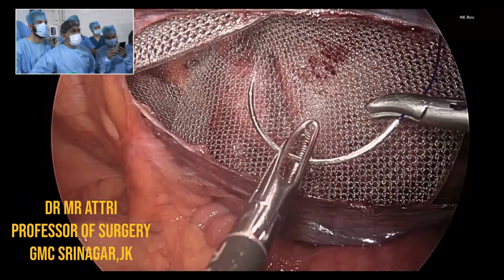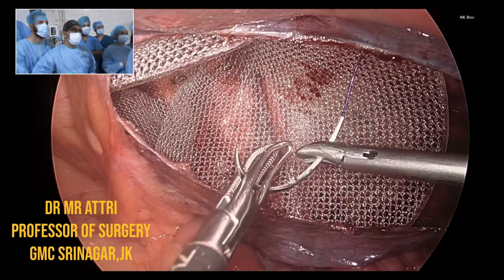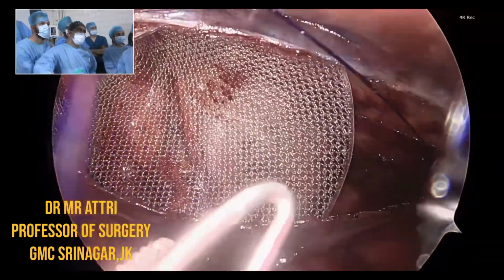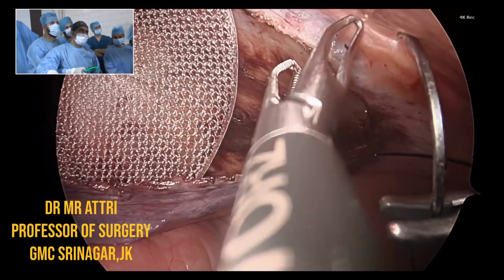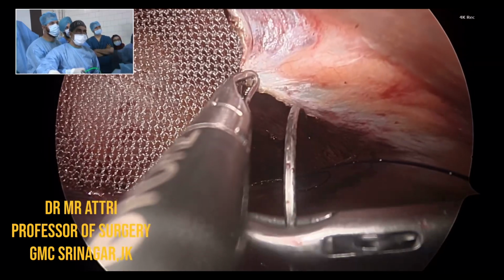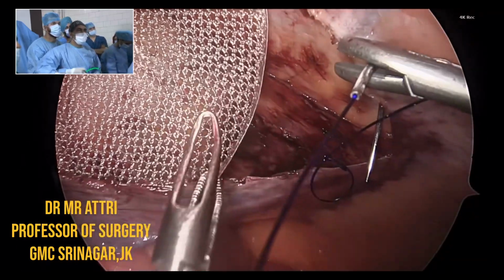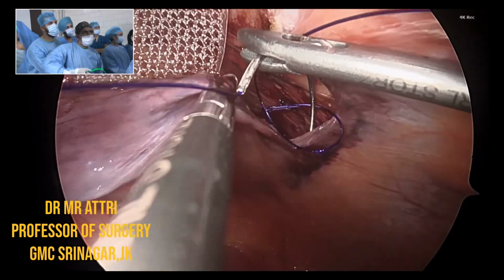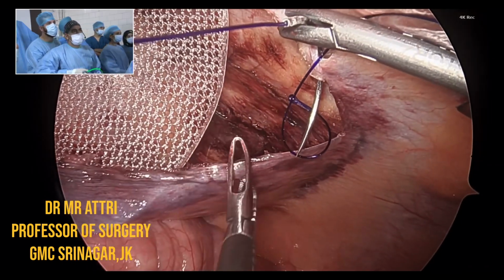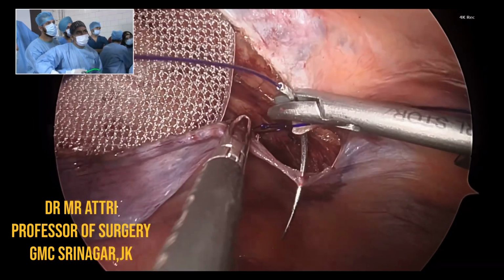Yes, we can. There is no need to dissect the sac up to the fundus in the scrotum. We can transect the sac, and that's what we call a herniotomy or circumcision of the sac. We can keep the distal sac as such, or we can fix it. It's not that fixation; we are just discussing a large direct hernia. There is a big pseudo sac, not a sac.